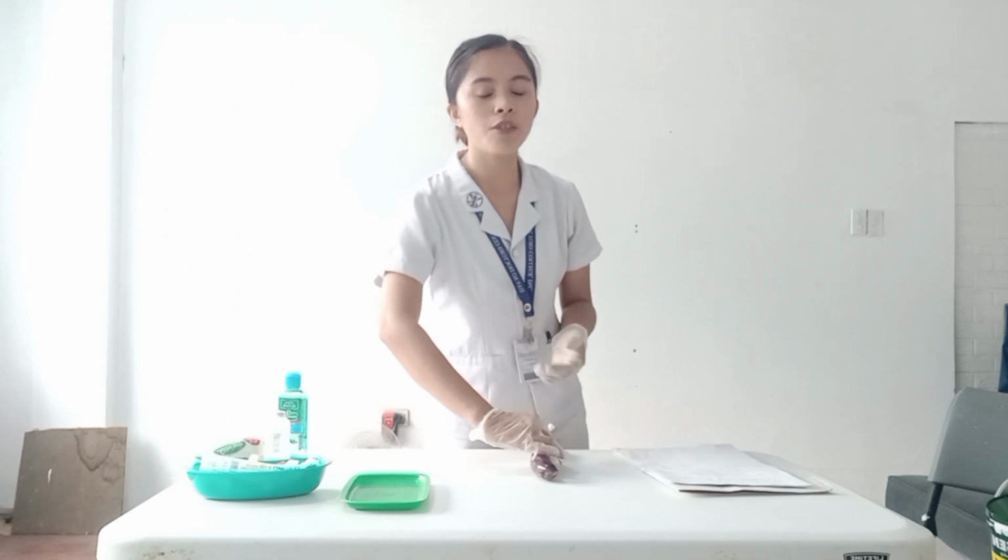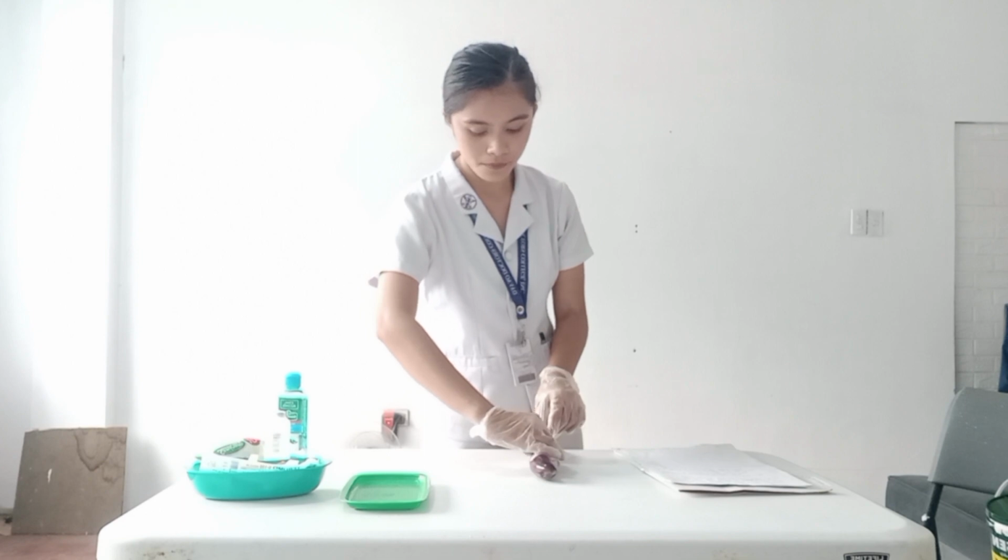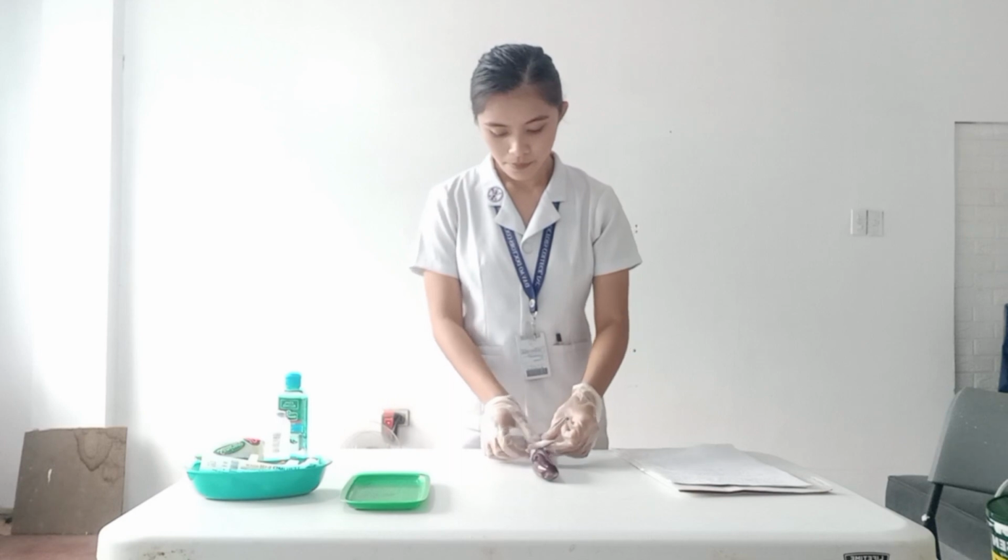Now remove the needle smoothly by pulling along the line of the insertion while depressing the skin with your non-dominant hand. If bleeding occurs, apply pressure to the site with dry sterile gauze until it stops. Now assist the patient into a comfortable position. Then do the aftercare of the materials used. After that, I can now remove my gloves and perform hand hygiene.